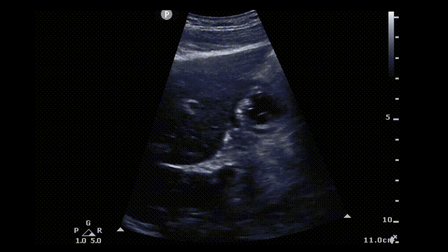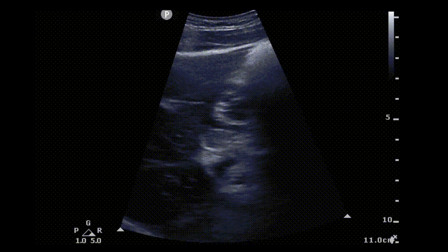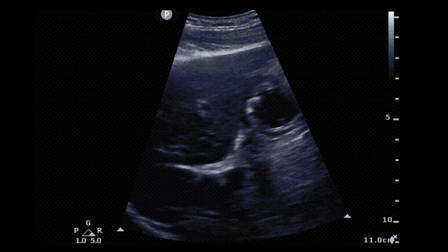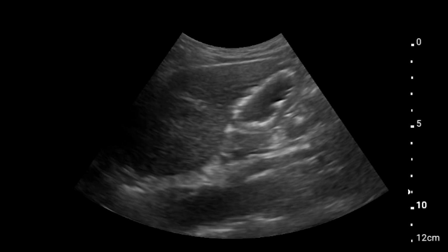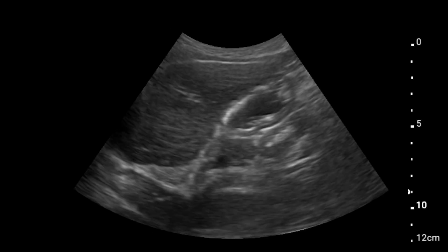We mentioned earlier that the normal gastric volume is typically less than 1.5 mL per kilogram. Qualitatively, it may be challenging to determine whether what you see on the scan is more than this expected baseline secretions threshold. How thin does the wall or how round does the gastric antrum need to be before we consider the stomach to be full of fluid? For this reason, we need to quantify the amount of fluid by using models that approximate the volume of fluid in the stomach, which gets us to the next section of the lecture.